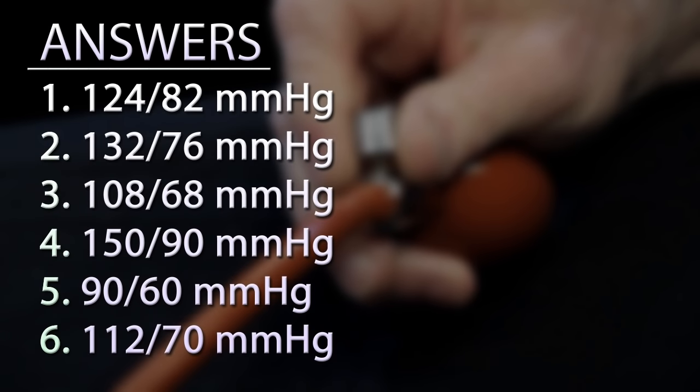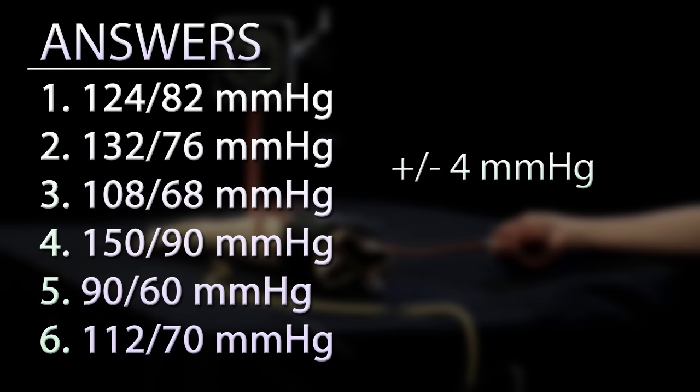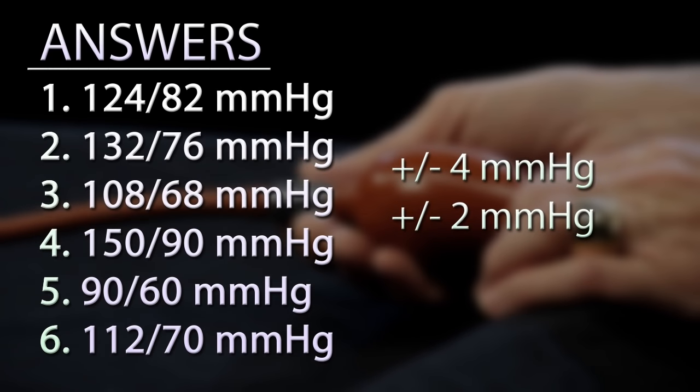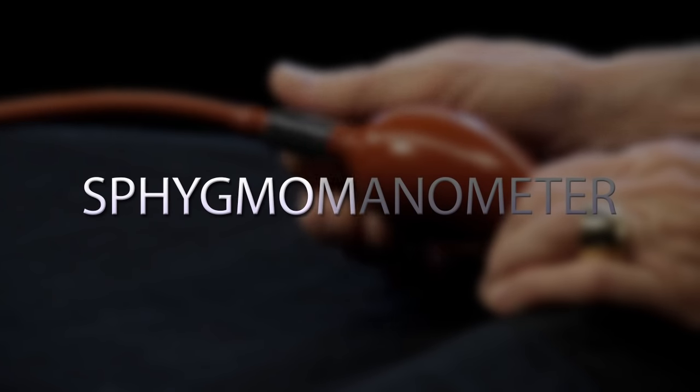Did you all come within plus or minus 4 millimeters mercury with your readings compared to the answers? That is the standard for accuracy for our course for the skill of measuring blood pressure. After some practice, you will come within 2 millimeters mercury compared to another person listening with you to the same blood pressure. You were not born knowing how to do this. It takes practice. Now, one more time, everyone say sphygmomanometer.